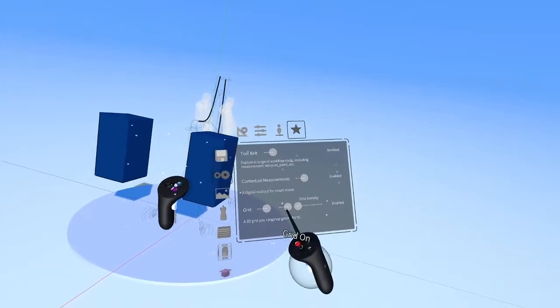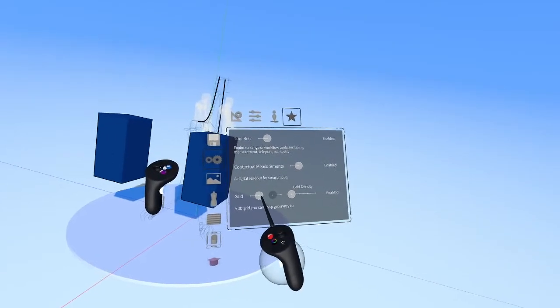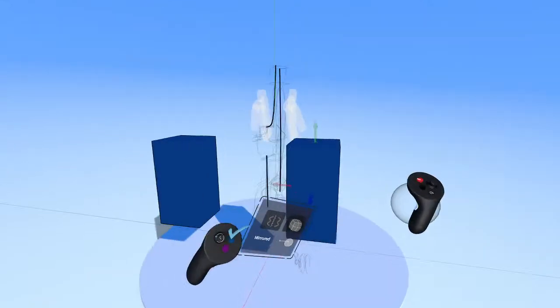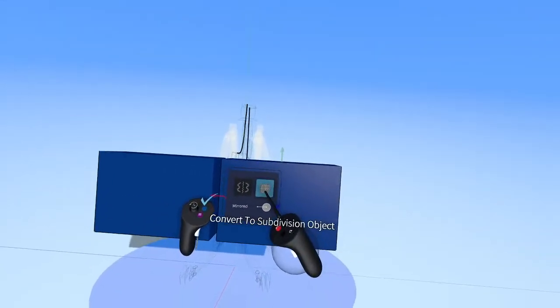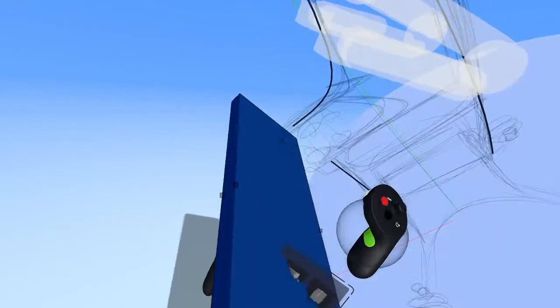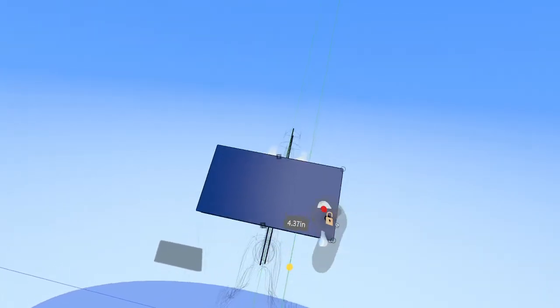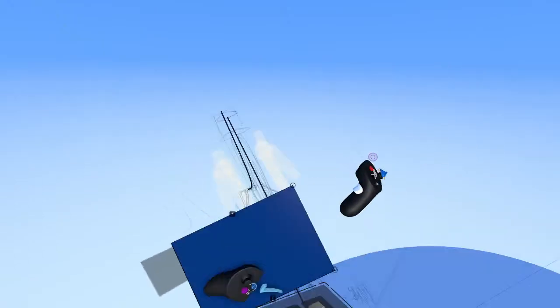Now, that's all we need the grid for. We can come in here again and turn it off. And by the way, this is on and off, and this is enabling it and disabling it. And now that it was placed precisely, we actually don't need to worry about the grid anymore. We can just shape it, convert it to sub D, and all our other movements are very precise. So usually I just use the grid for placing objects. And then after that, I turn it off.